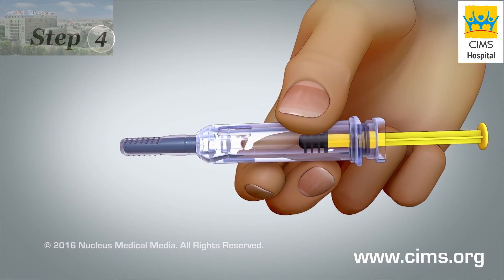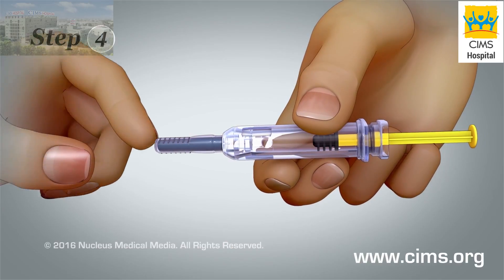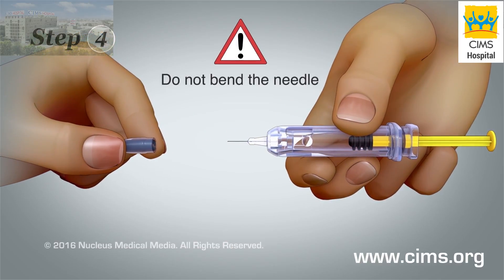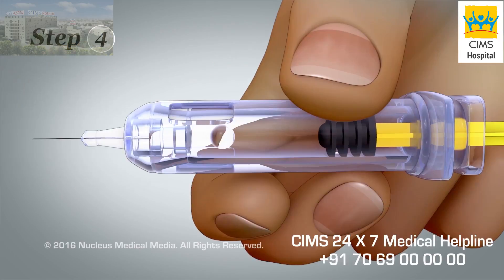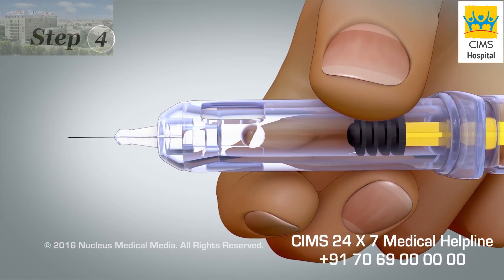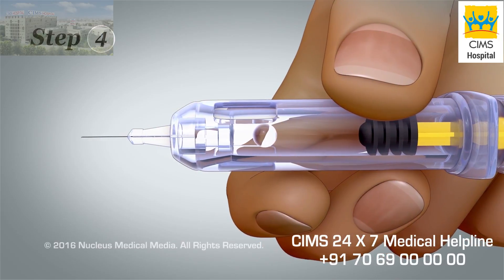Step 4. Hold the syringe sideways by the barrel, then pull the needle cap straight off without bending the needle. There will be an air bubble in the medicine. Do not press the plunger to squirt the air bubble out of the barrel.